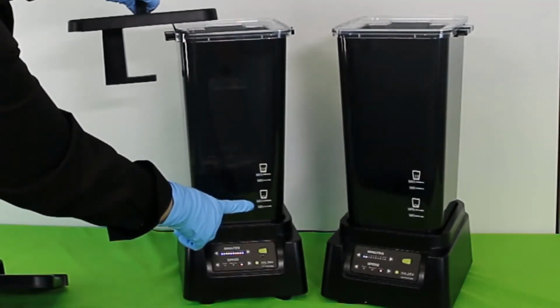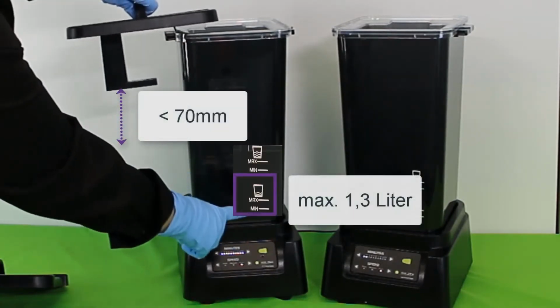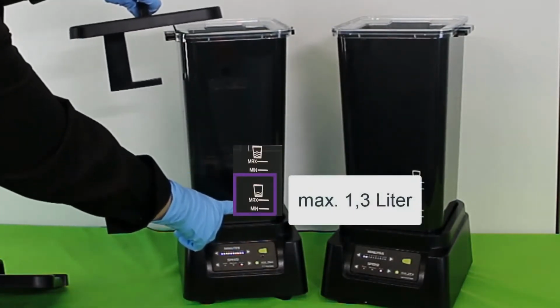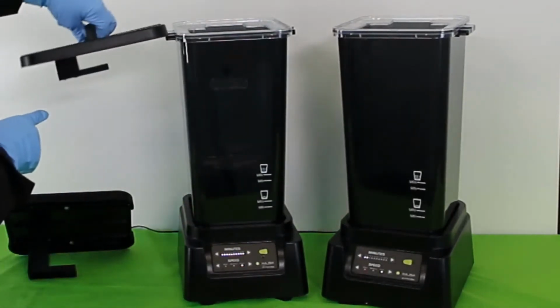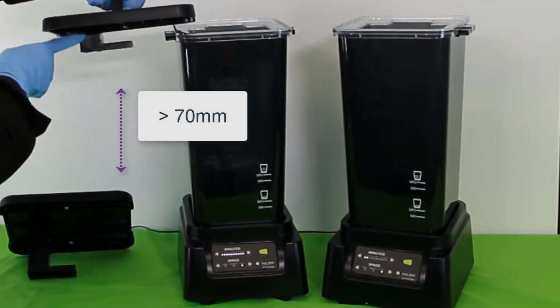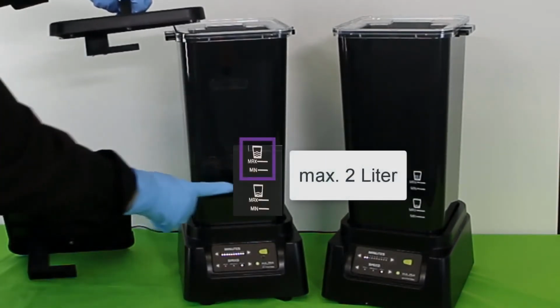The large build table hanger is suitable for small objects up to a height of 70 mm and a maximum filling height of 1.3 liters of isopropanol. The small build table hanger is for objects over 70 mm height and a maximum filling height of 2 liters of isopropanol.